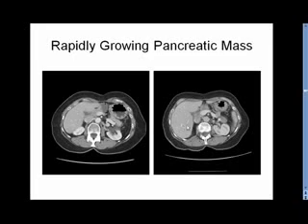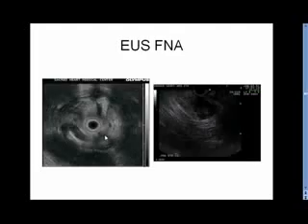And 3 months later, this little mass has grown into this much bigger mass, indicating a very rapid growth, which may be related to the underlying genetic problem. But on endoscopic ultrasound, this is the way it looks on the radial scan. And here, fairly dark, the appearance of that same mass as taken with the biopsy curved linear array instrument. The biopsies were positive for adenocarcinoma. The patient had surgery, and it turned out to be a T1N0 lesion, so she is expected to be cured.